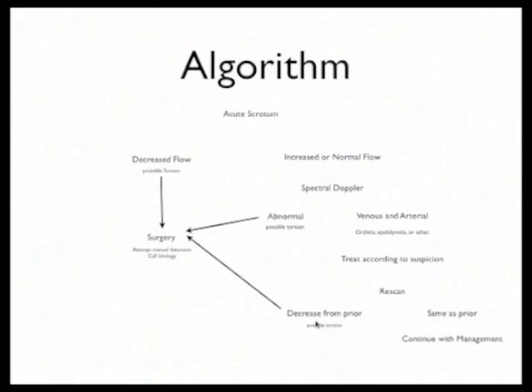However, if the testicle looks the same still after treating them, they're feeling better, their pain's not going up, you scan them again, and it's not decreased more from, maybe it was just really early and they had a venous waveform. I don't know if that exists or not. I don't know if you can have pain and still have your venous waveform on spectral, but there's another reason to rescan them to see if anything's changed. And if it's totally the same and you still think it's orchitis epididymitis, then I at least have sent these patients home in this case, and I felt comfortable doing this.